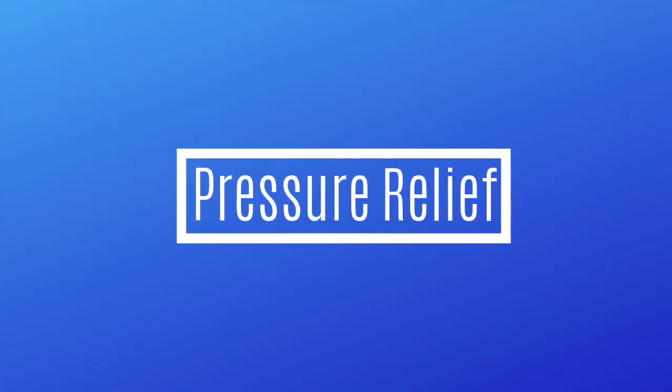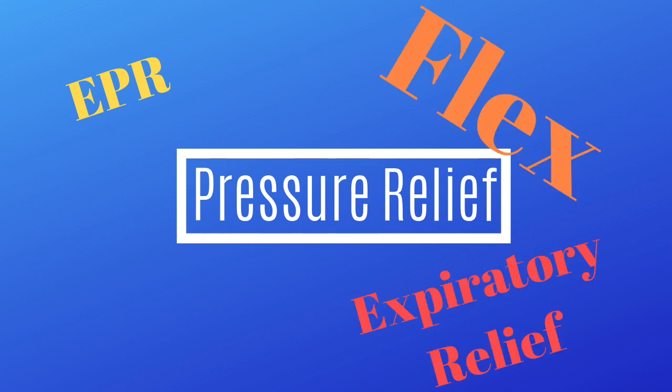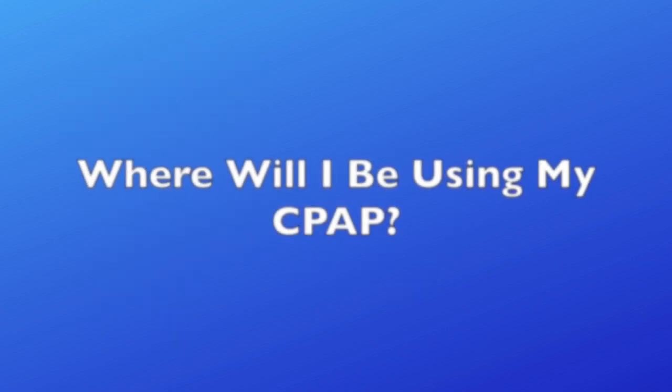As far as pressure relief, depending on the brand, this can all be called a different thing. EPR, expiratory relief, flex, they are all the same. What pressure relief actually does is lower the pressure when you exhale. This makes it so you are not fighting against the air pressure and can breathe a bit more naturally through the night.